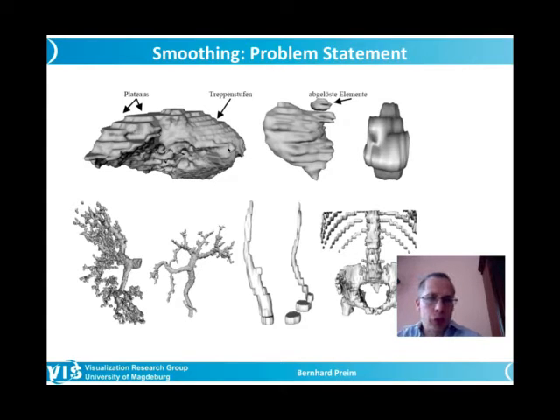To further illustrate some problems, we talked about these plateaus and staircase artifacts. We also have detached elements. And to comment on this already, if you have detached elements, this problem will not be solved with a smoothing algorithm. In contrast, the detached elements typically after smoothing have a larger distance than they had before. So they look even more detached.